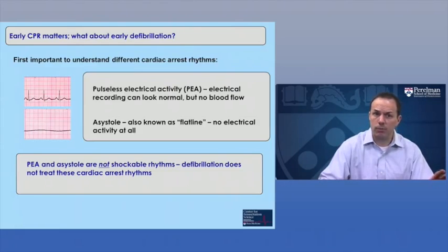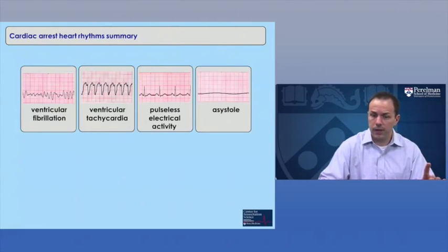So I want to introduce this to point out that this is where it gets sophisticated. If you're going to use a defibrillator, you have to know which is which. I should say that is if you're going to use a manual defibrillator. It turns out automatic defibrillators, the ones in airports, gyms, and malls, can automatically identify which of these four rhythms a patient is in. These patients that need a defibrillation, an AED will shock automatically, or if you're a healthcare provider and you see this rhythm, you know to give a shock.